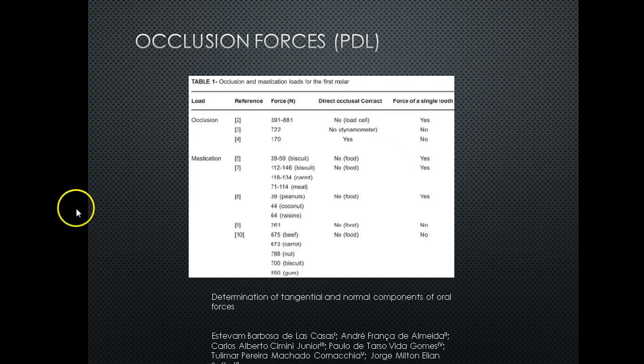I've seen that with full mouth restorative fixed cases, that it takes time, and there are times where you actually have fractured prostheses. We have made measurements, anecdotally, and seen how their bite forces changed before and after the prosthetic, because they lose that ability to know when to stop or how much it requires to eat the same thing. So that's one thing we have to figure out and be careful about.